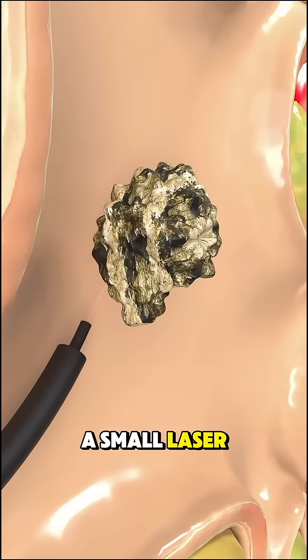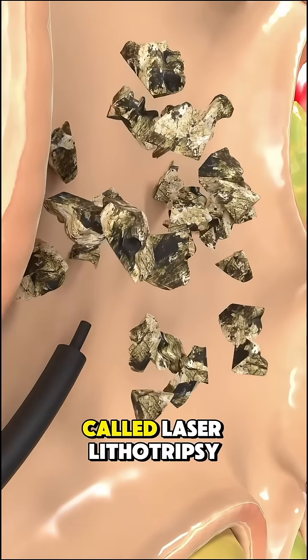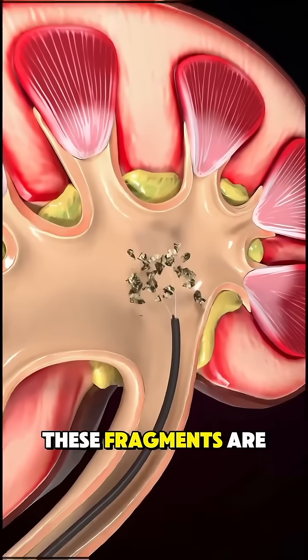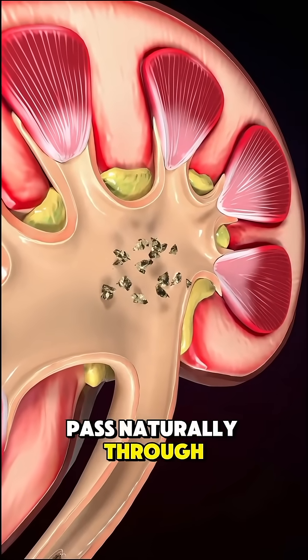Once the stone is seen, a small laser fiber is used to break it into tiny fragments in a process called laser lithotripsy. These fragments are either captured with miniature baskets and removed, or left to pass naturally through the urine.